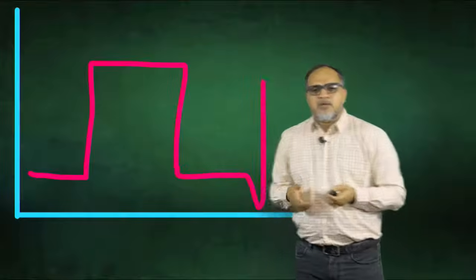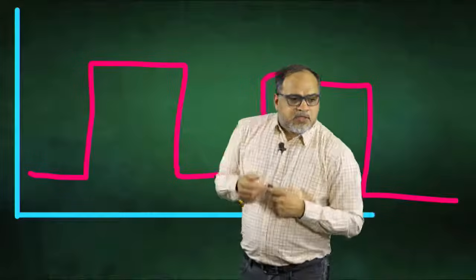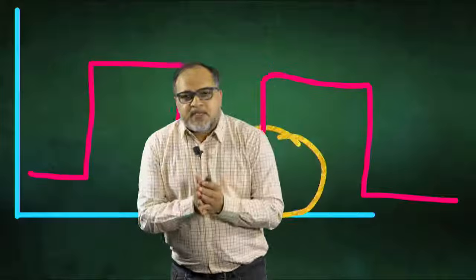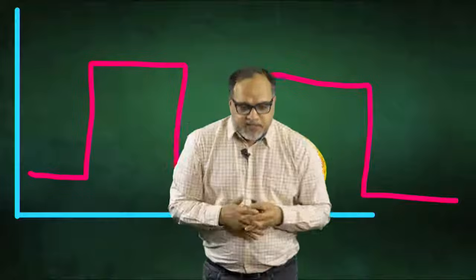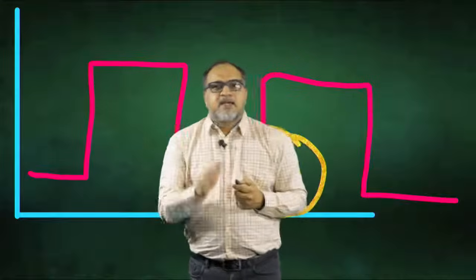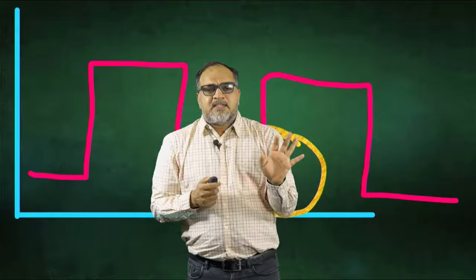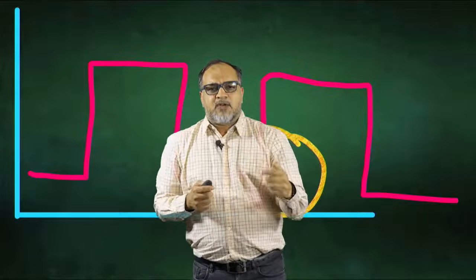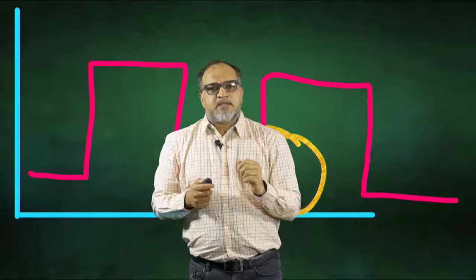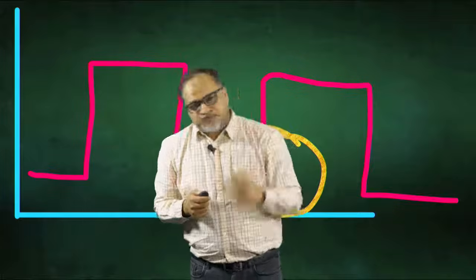In a pressure controlled mode, it will look like this. So, the breaths could be patient triggered or ventilator triggered. Ventilator triggered breaths are mandatory breaths, and time triggered breaths. The ventilator doesn't understand anything. You just have to tell it 15 breaths per minute, and it will count 1, 2, 3, breath. If you tell it 10 breaths per minute, it will count 1, 2, 3, 4, 5, 6 second breath.